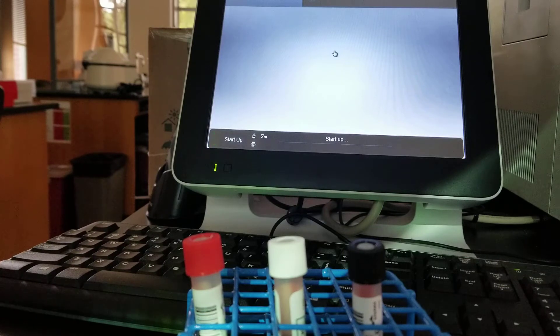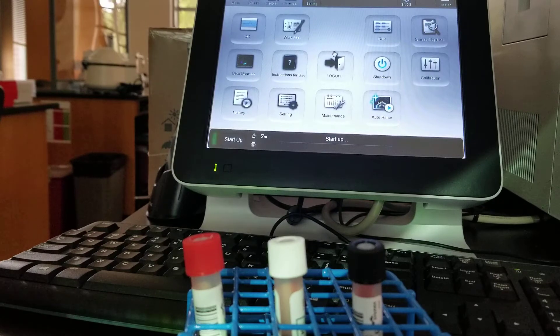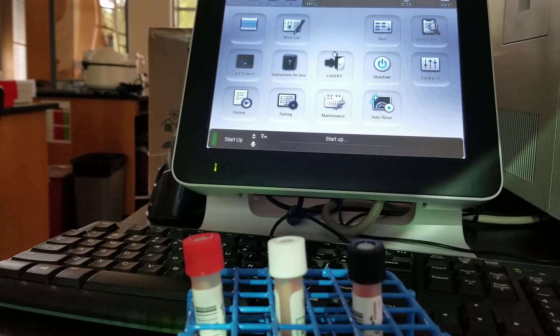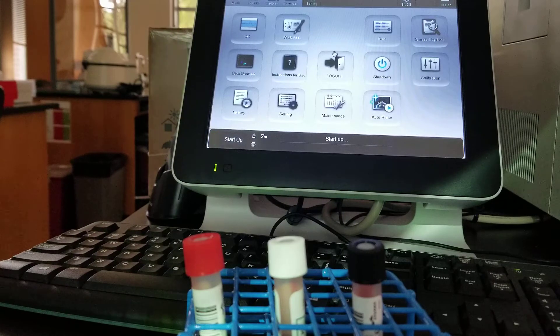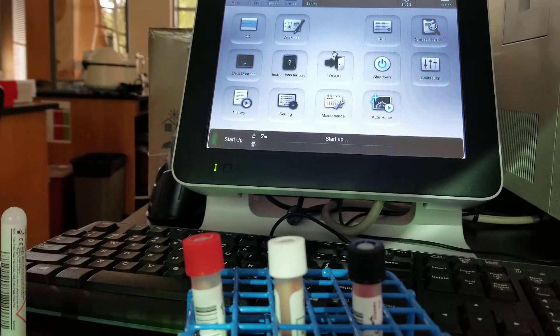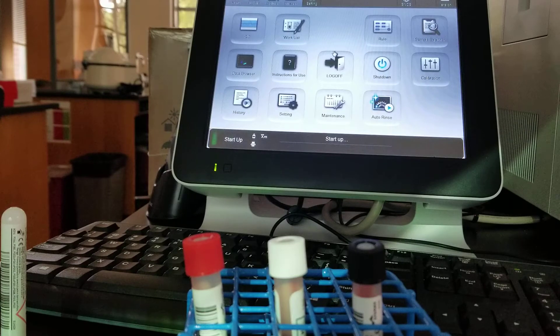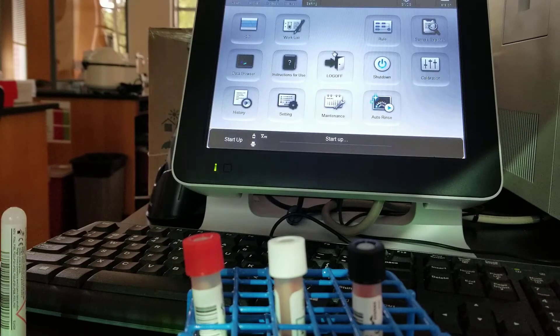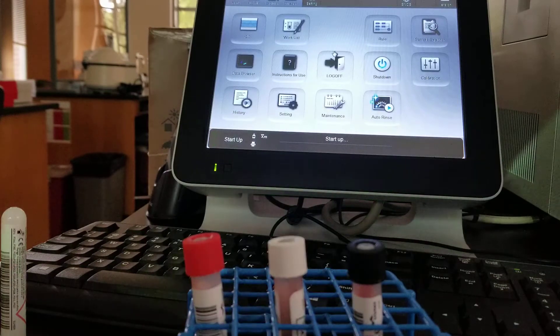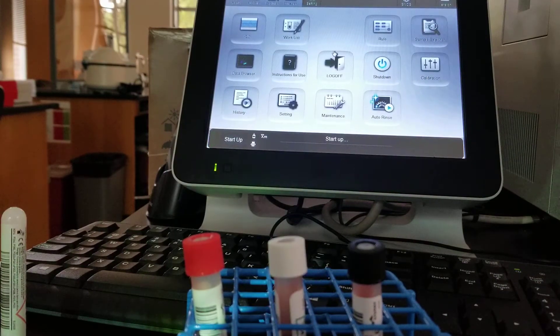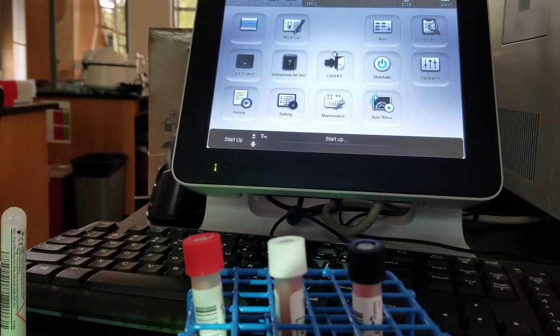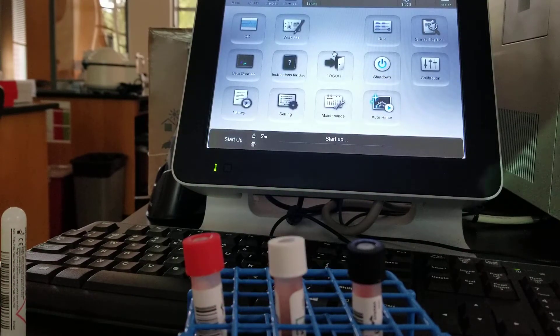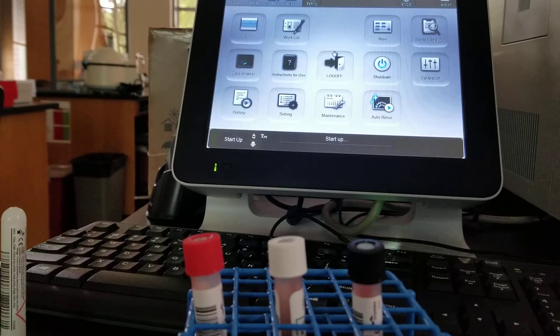It's still starting up. At this point, you want to make sure that you've been letting your QC sit out to room temperature. We're still not going to get to run it first because it's going to have us run the cell clean auto. I'm just waiting for it to say that. It's still doing its self checks.